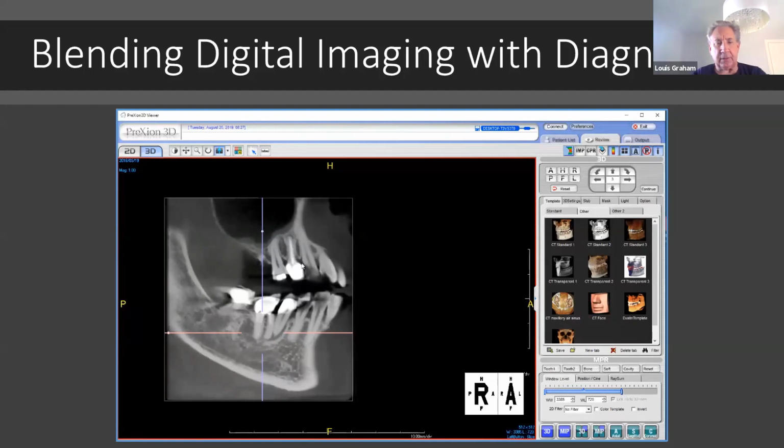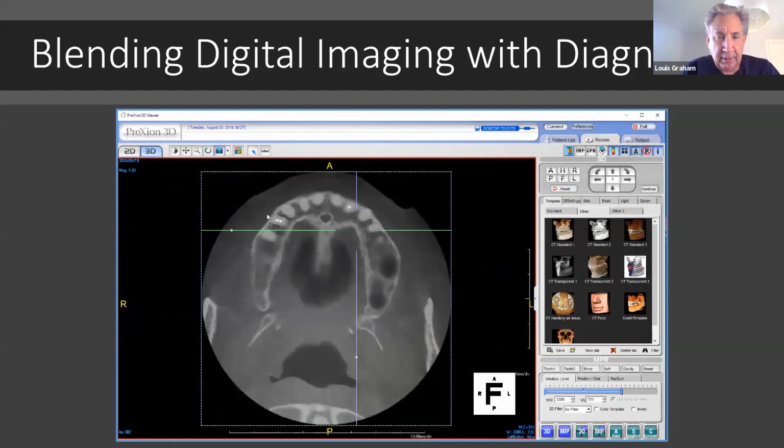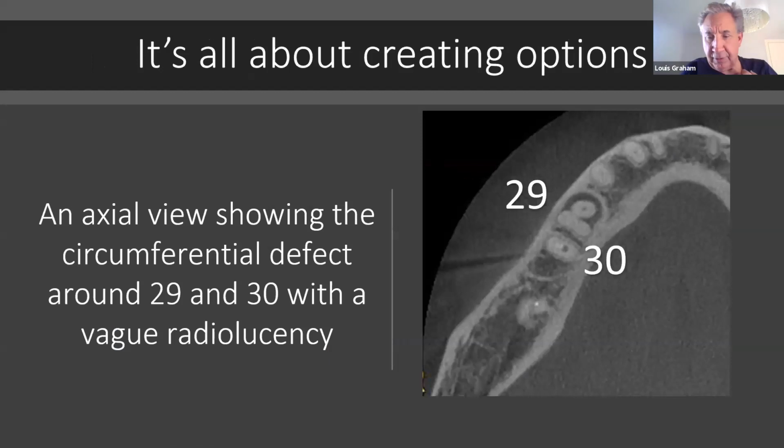I can see some, we'll say, periapical radiolucencies on the upper teeth. I can't say they concern me, but again, this gives me so much more information than a 2D image. Let's go look at it a little closer. Here's 29 and 30 pixelated, so you can't go by the images, but here's 29 and 30. Nothing was on the x-ray, 2D.